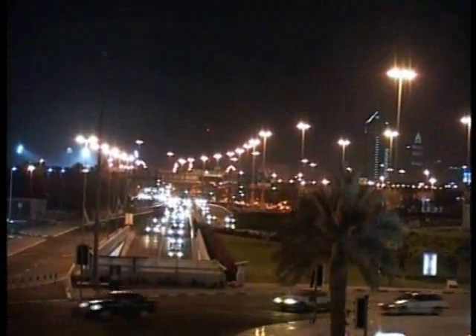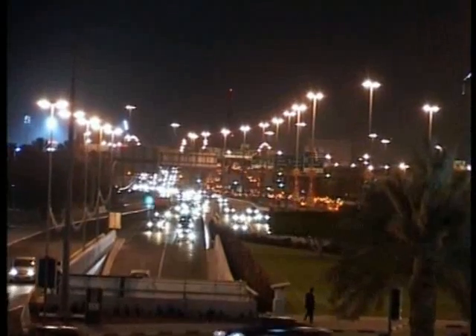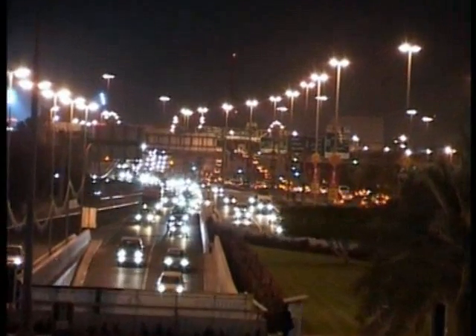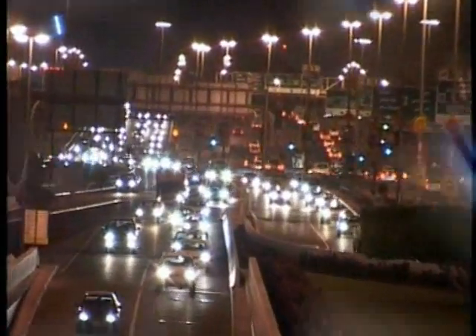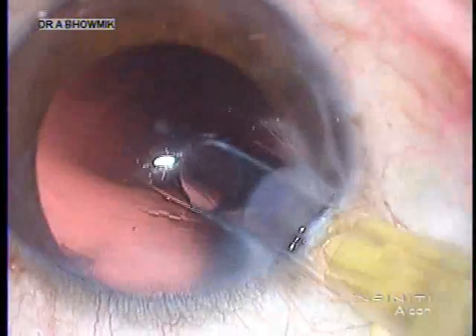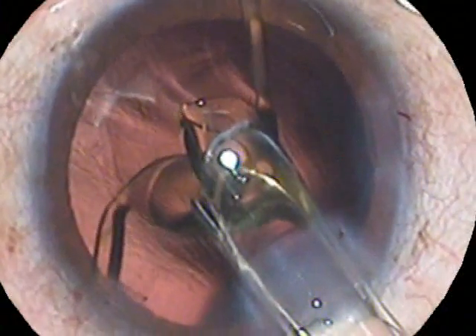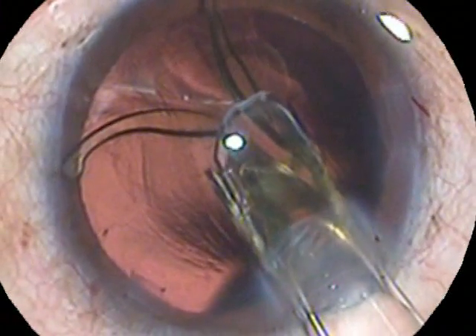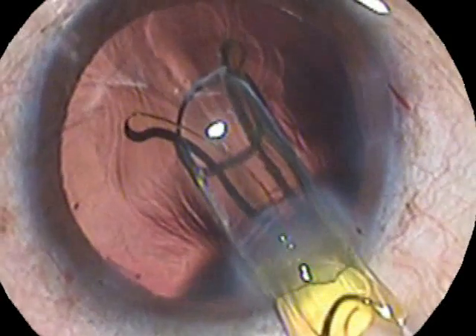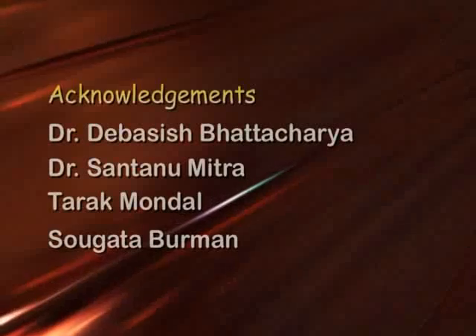We often tend to defer or postpone IOL exchange because it is a difficult procedure through the same small incision. The final visual outcome of cataract surgery should never be compromised. This simple, reproducible technique can be most effective for in and out through the same incision. Thank you for being in and out through the whole video.